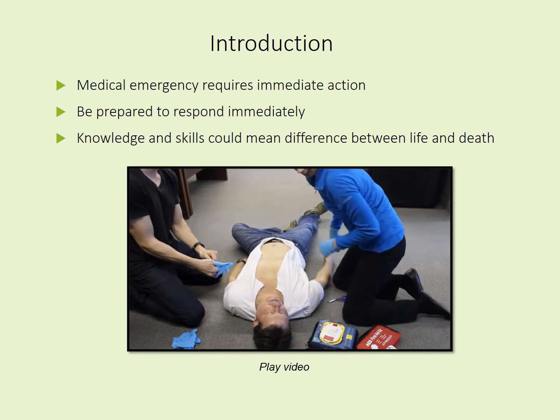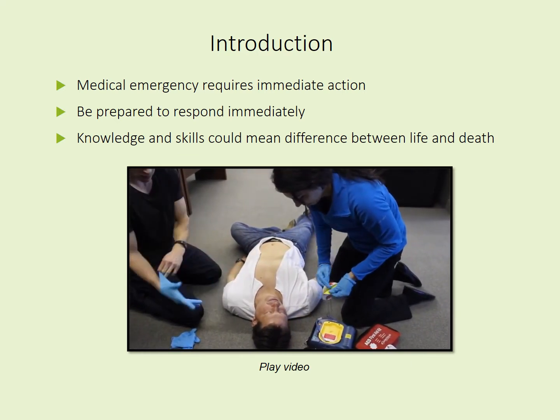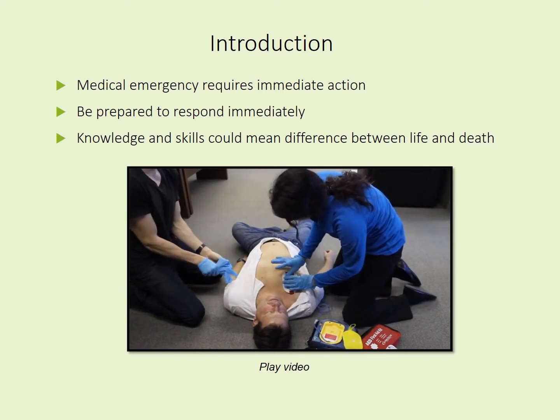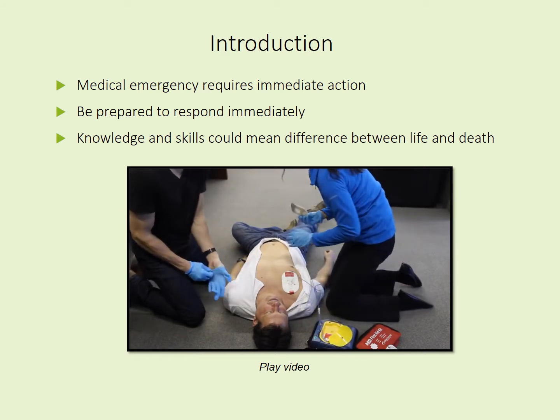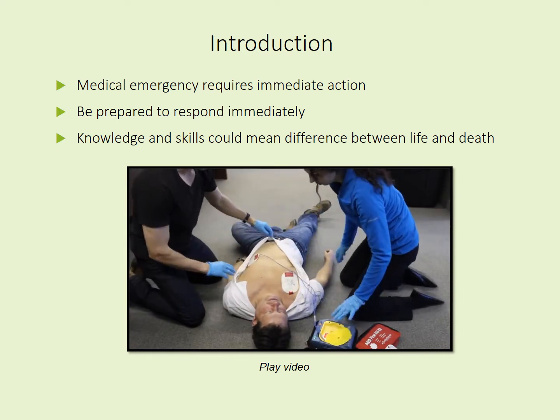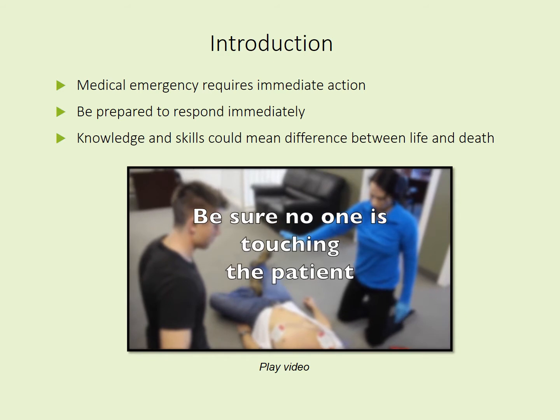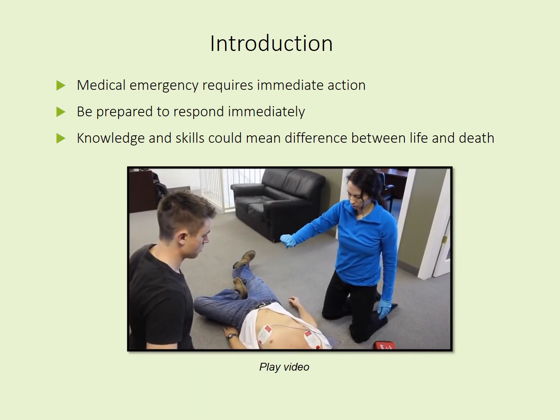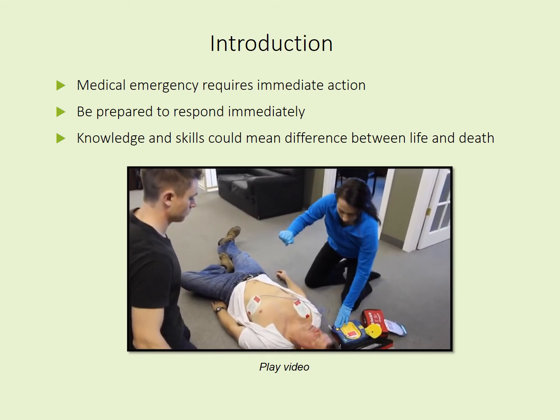Place pad exactly as shown in the picture. Press firmly to patient's bare skin. No one should touch the patient. Analyzing. No one should touch the patient. Shock advised. Stay clear of patient.